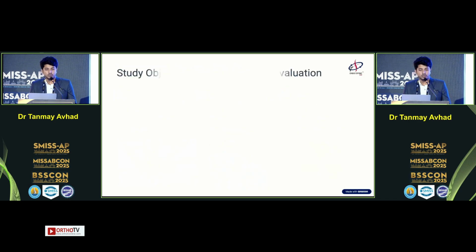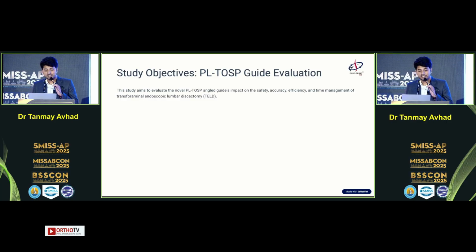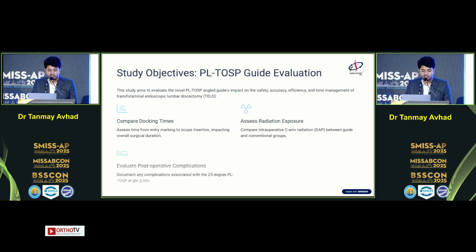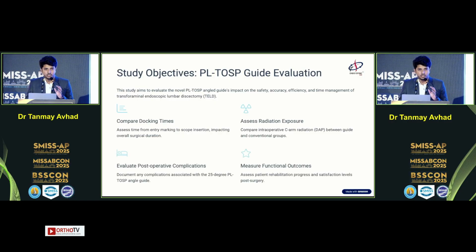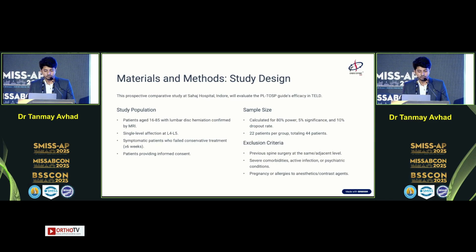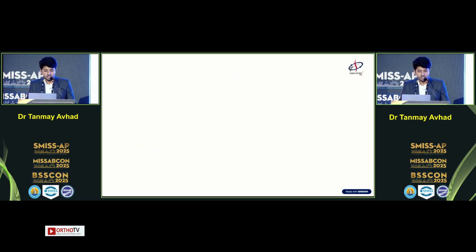But we also had to understand the feasibility and its results. So we wanted to study the outcomes in a control group and a test group, which compared docking times, radiation exposure, and postoperative and functional outcomes to assess its safety. These were the materials and methods and the study design we used for this study.